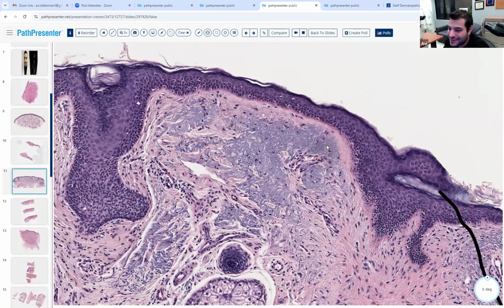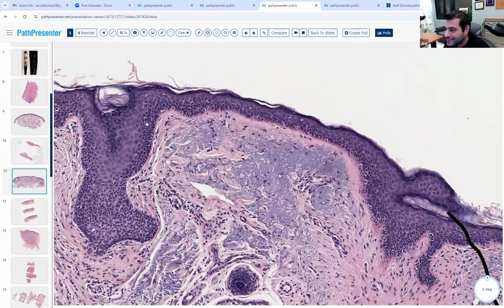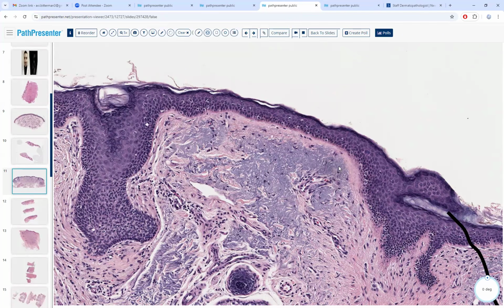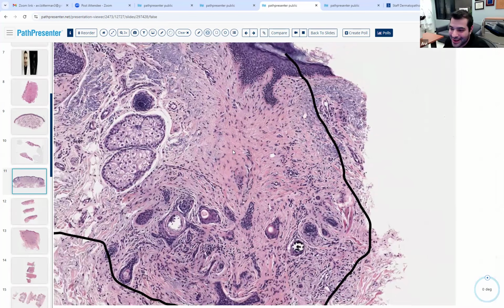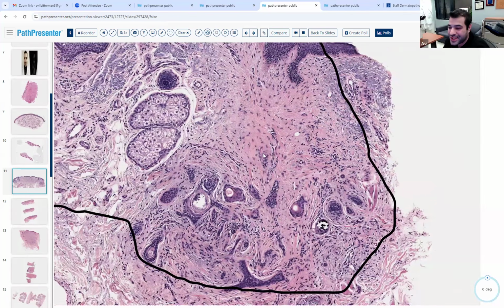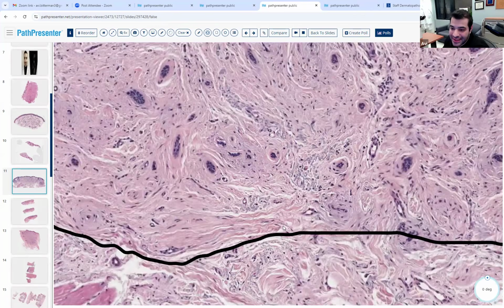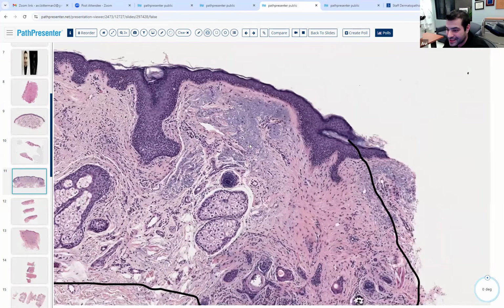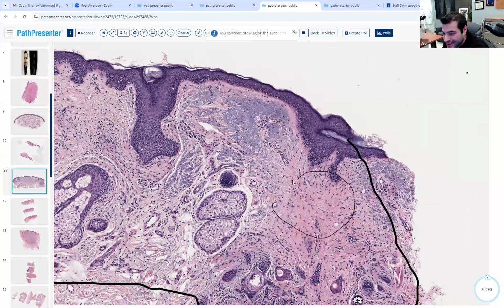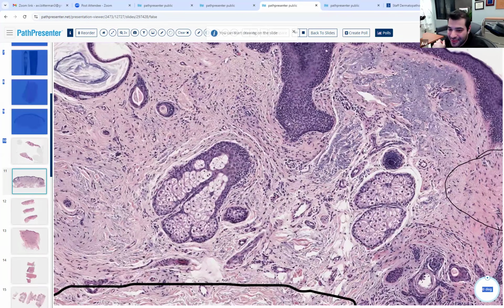You see how this is the normal skin? What does the normal skin look like here? Come on, you know what this is. Oh, it's also solar elastosis. It's a bunch of solar elastosis, right? And now look when you get to the stroma of the tumor. All of a sudden, the solar elastosis is gone and it's replaced by all this red stuff. It almost starts to look like you have this beautiful new collagen. Here it's somewhat more myxoid, but you can clearly see there's some almost replacement, especially in this area. So it's like these fibrotic areas, a really fibrotic area of stroma.